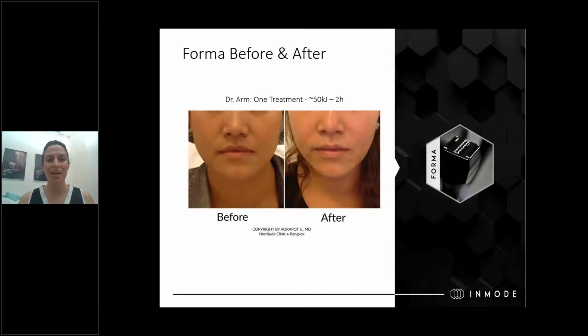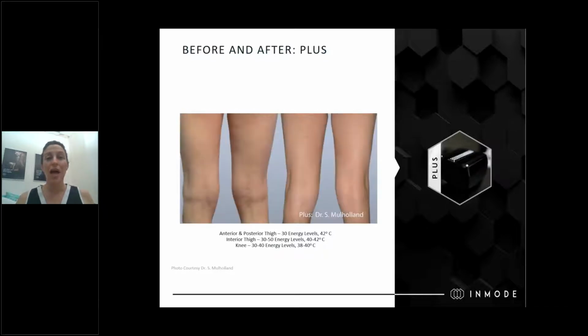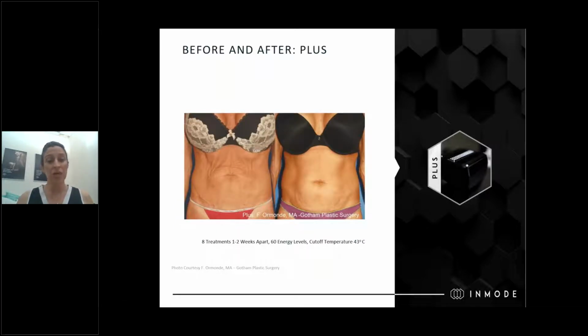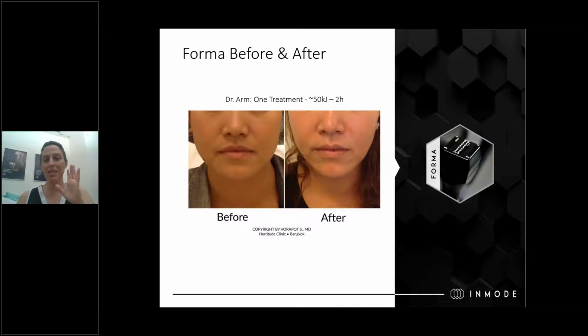Now this is actually something that I like doing during my hands-on part, and today, unfortunately, since we're working with Lisa instead of a real-life patient, I will be slightly debilitated. I won't be able to demonstrate it, but what I normally do is show what I call a split face. I treat half the face, and then I let my patient sit up and look at the difference, and they see this V shape immediately.